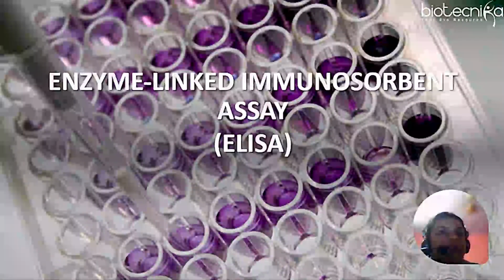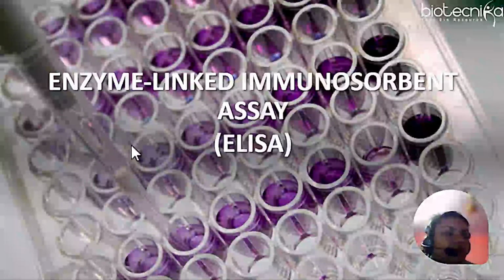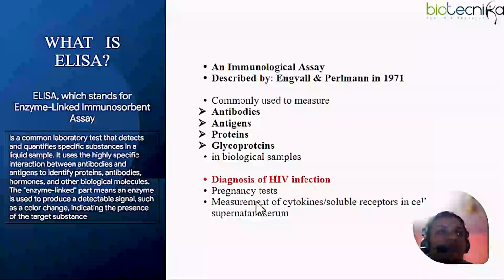Second, we will be studying about ELISA. ELISA is known as enzyme-linked immunosorbent assay, very commonly used in most biotech labs, molecular biology labs, and immunological labs. This is a very common laboratory test whenever you want to detect or quantify any specific antigen, protein, hormone, or any specific substance present in a given liquid sample. It uses a very highly specific interaction between antigens and antibody.